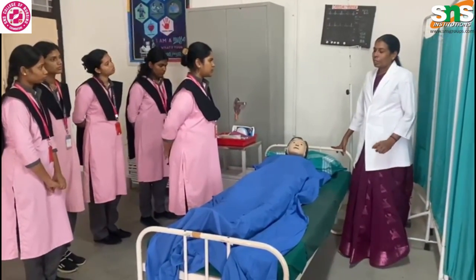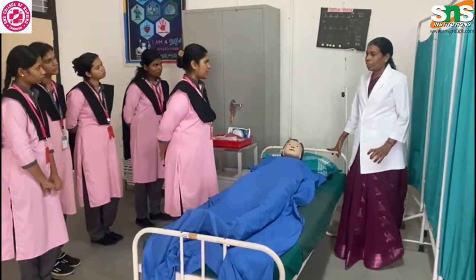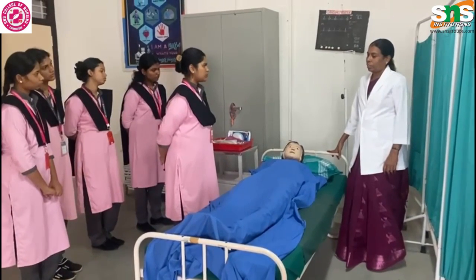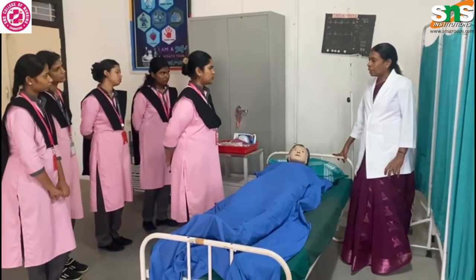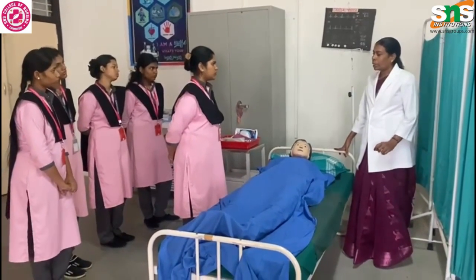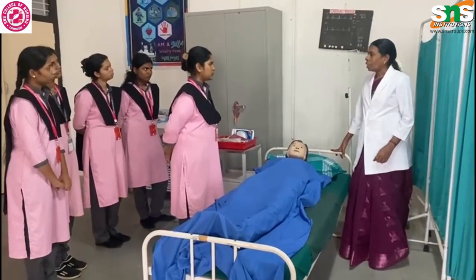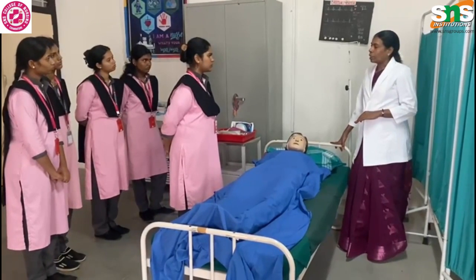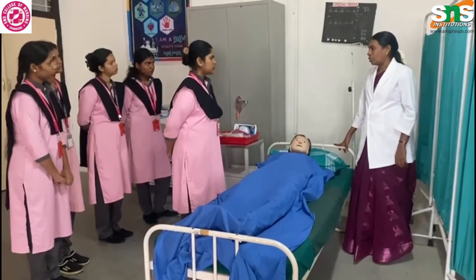Okay, if the tube is not in the correct position, how do we check? Some signs and symptoms are there. That is, the patient is having continuous cough or choking or irritability, dyspnea especially. If the patient has these symptoms, you have to remove the tube immediately and wait for some time. Then reassure the patient. After that, again continue. You have to repeat the procedure.